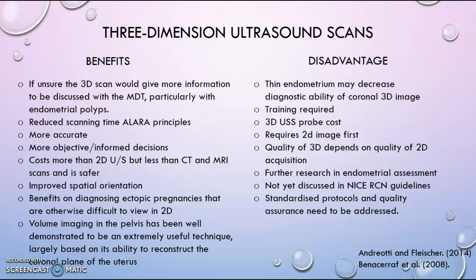Outlined on the slides are the advantages and disadvantages to 3D ultrasound scanning. Though there are issues that need to be addressed, the benefits of 3D ultrasounds in patient care are clear and outweigh the disadvantages.